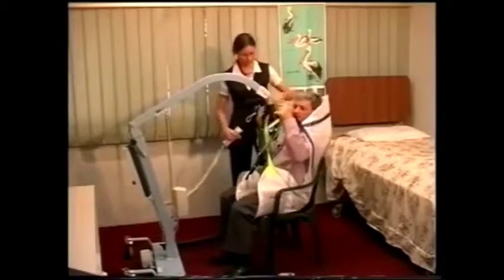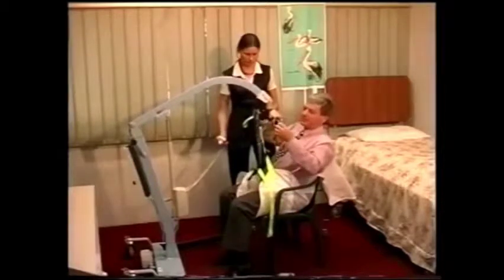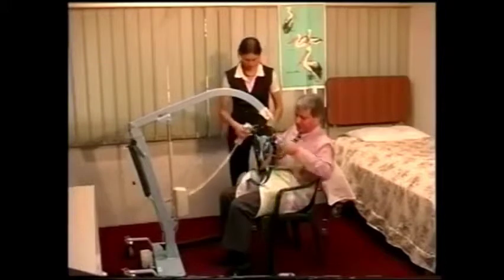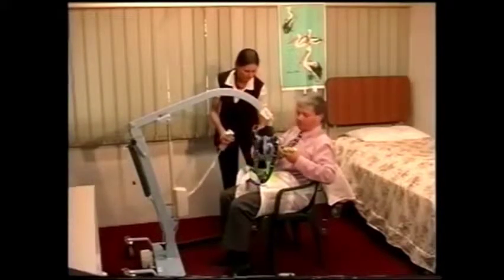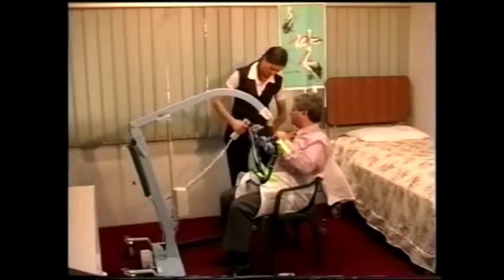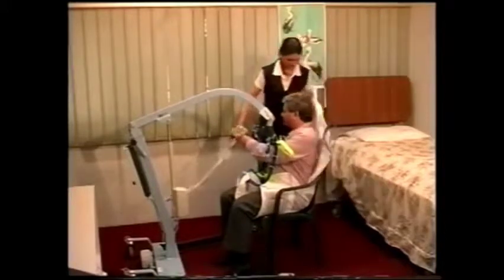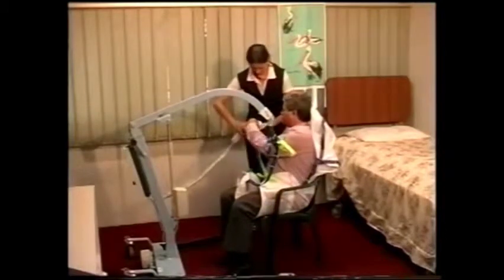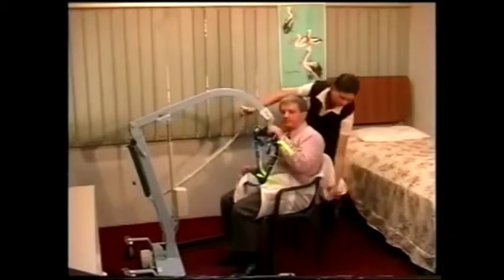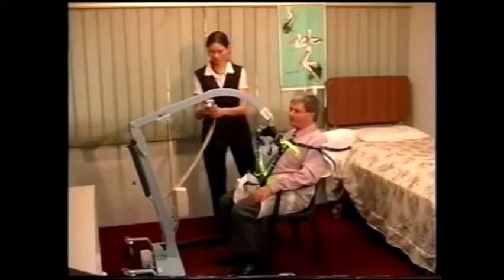And the last one we can do here is in a reclined position. I'll leave that third one on there. Stop. I'll put this back on. If you can put that on the very first hook on the back. Oh, this is going on the third. Yep, and the back one on the longest loop. That's it. Rightio. Now this is if you want to pick someone up in the reclined position.